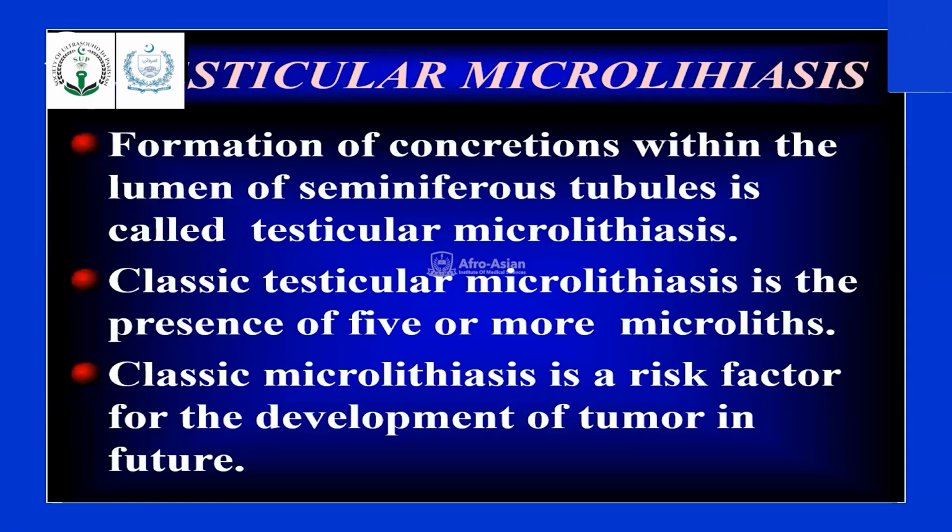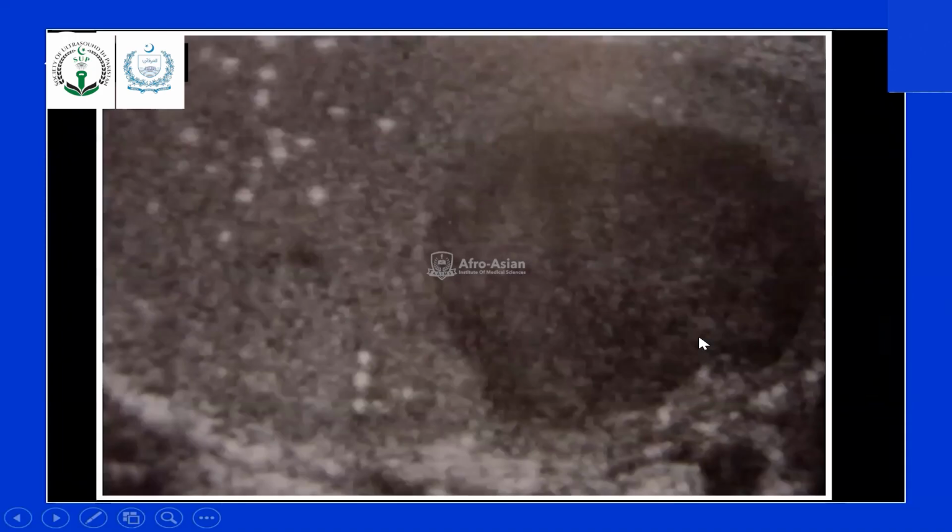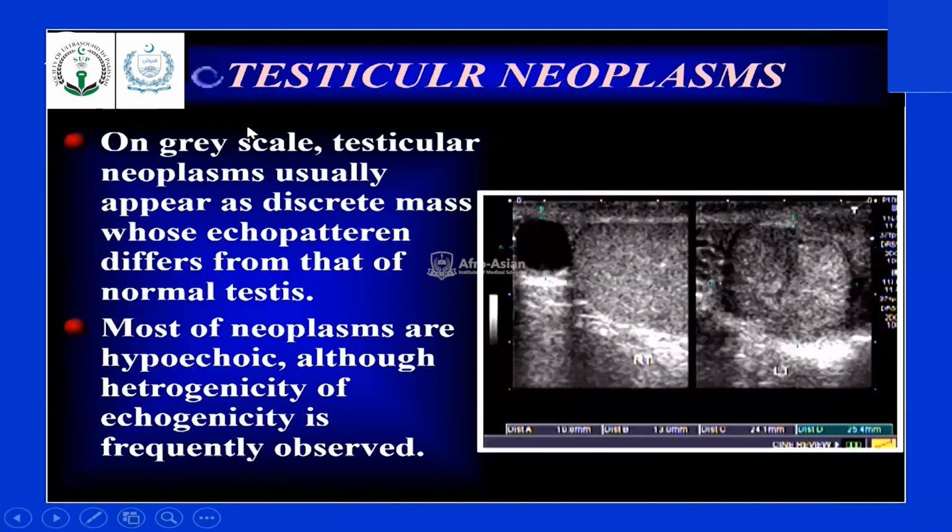Classical microlithiasis is a risk factor for the development of tumor in future. These are very small and visible on ultrasound. There it is again.